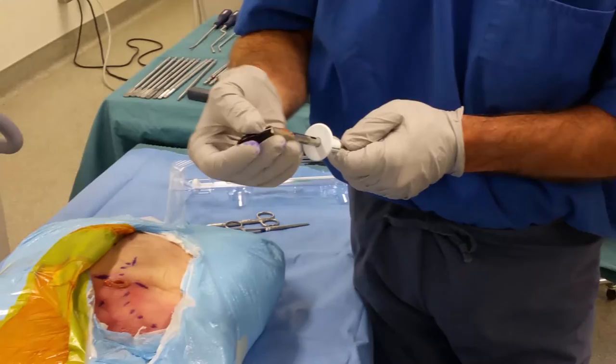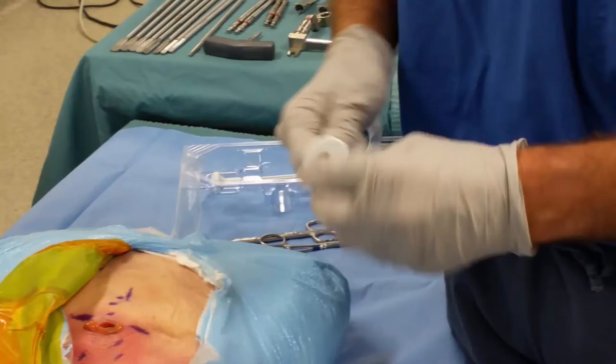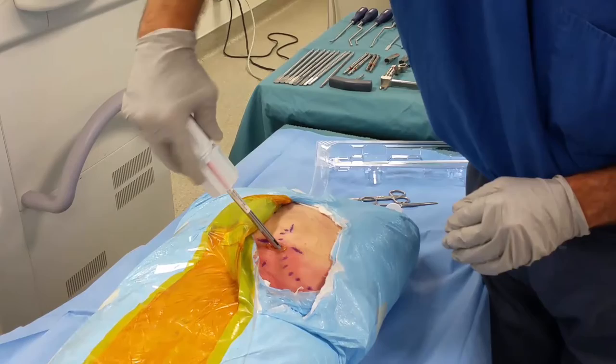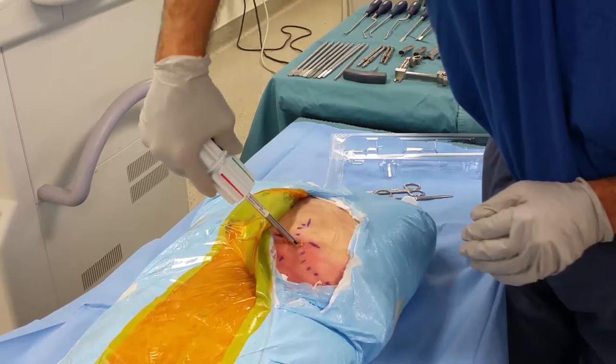There's a shoulder stop. You can put the vinyl cap back on for safety reasons, and then you can remove the trocar tip. You can take the release tool off. We're in the open position. It's an oscillating motion, and you can feel and hear that I'm basically going into the cancellous bone.